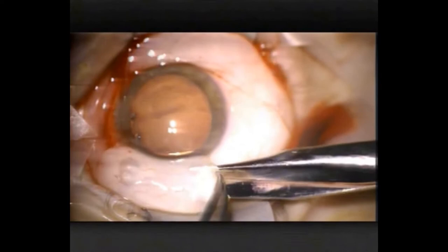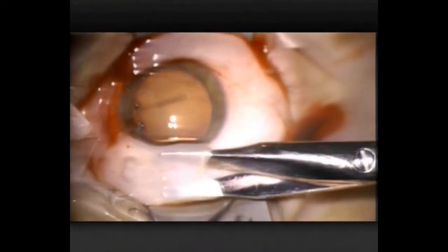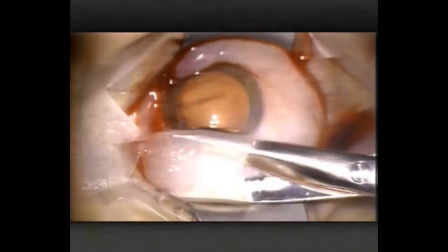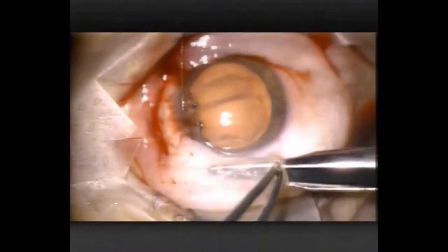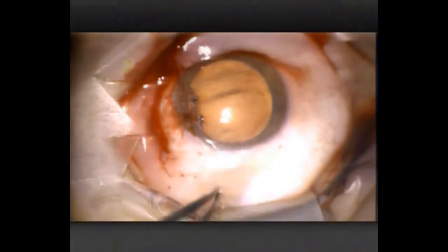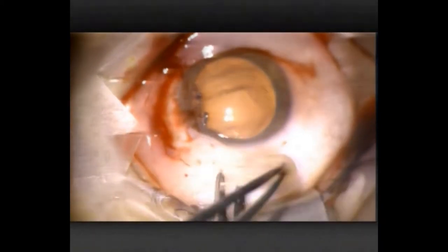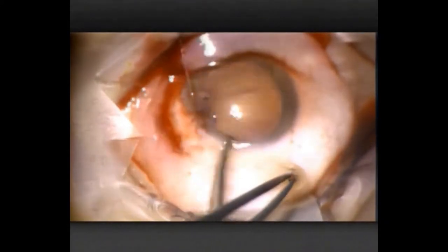There are two areas here which are fairly distinct. The area I'm dissecting now is peripheral, but there's a two-millimetre ring of conjunctiva that's fairly adherent to the Tenon's capsule. So if you can separate that as another layer, I'll sometimes cut between those two areas. If I can't, I'll just avoid that area and leave a cuff of two millimetres of conjunctiva at the limbus.